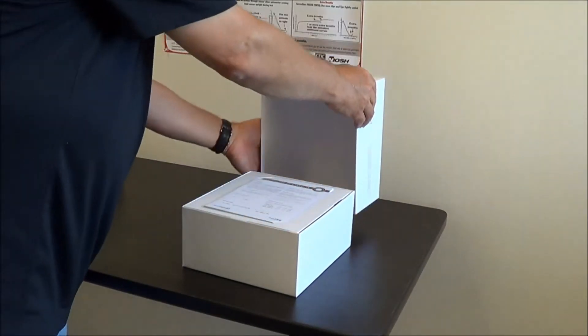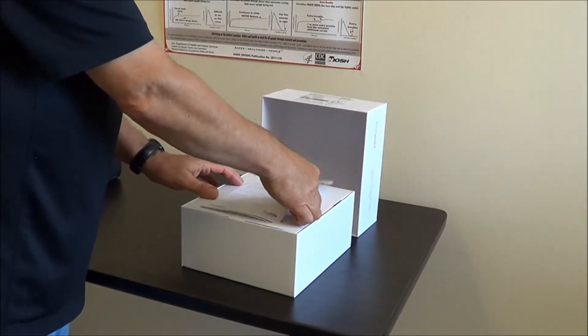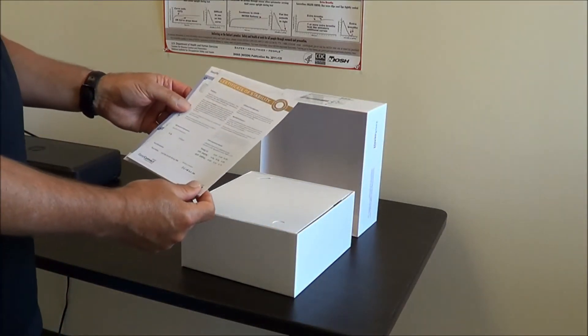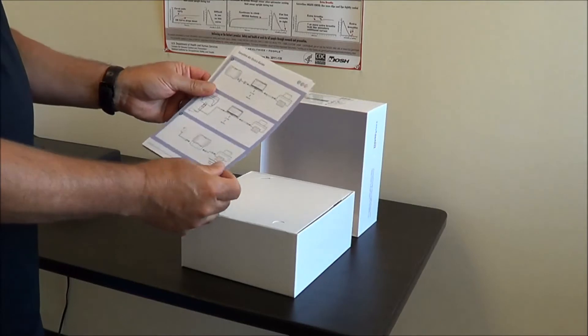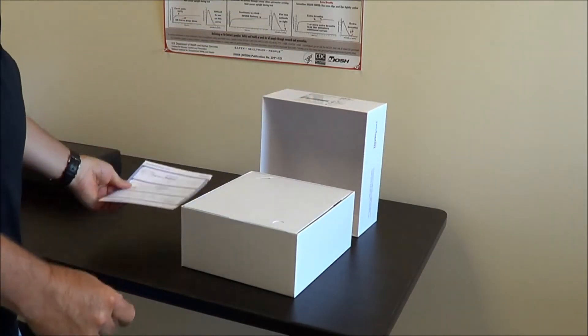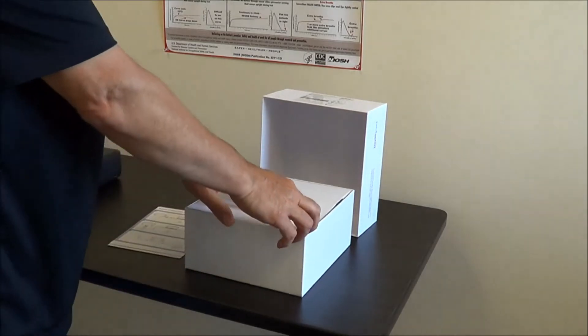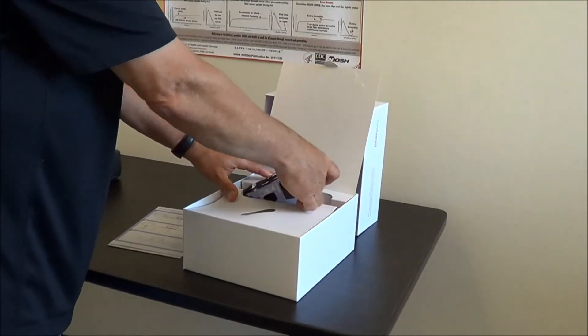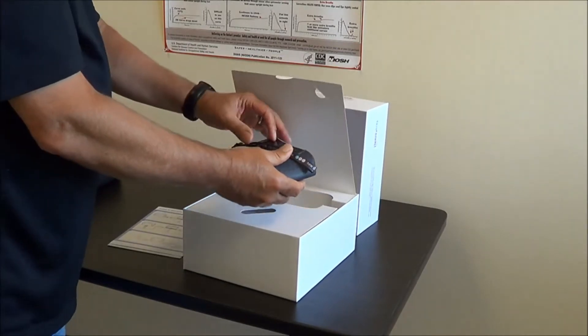Open the box. The first thing you see is their certificate of stability, which shows the calibration that occurred at the factory. And also a quick start guide, which is a pictorial of how to set the device up. Open that flap and now we've got the device — the EZ-1 air spirometer.